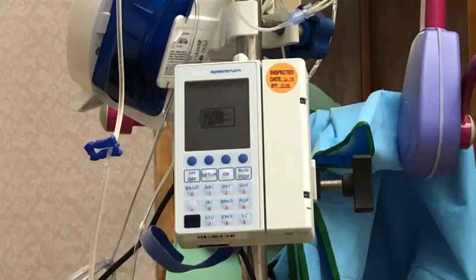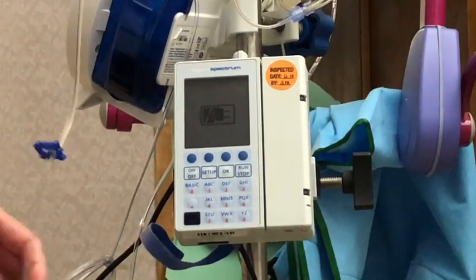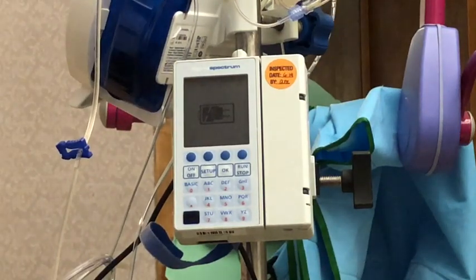Today I'm going to show you how to use our Sigma Spectrum IV pump so that when you get out to the floor you'll be able to use it without problems.